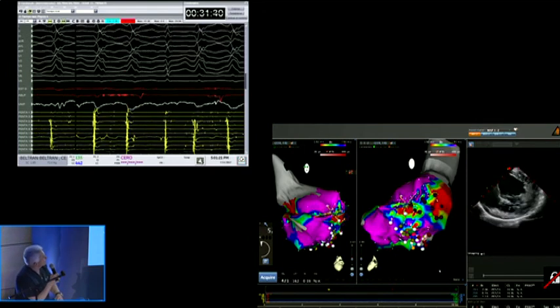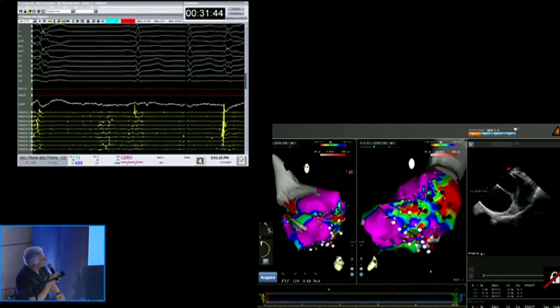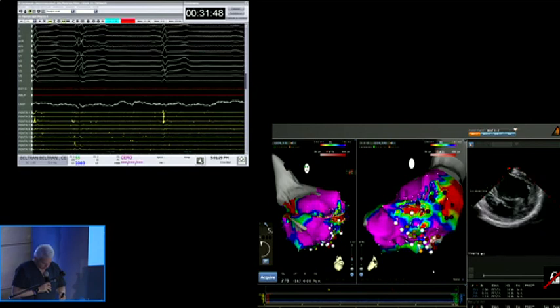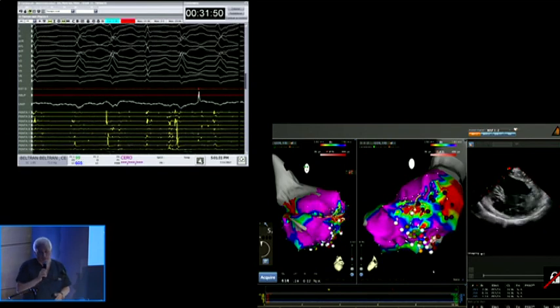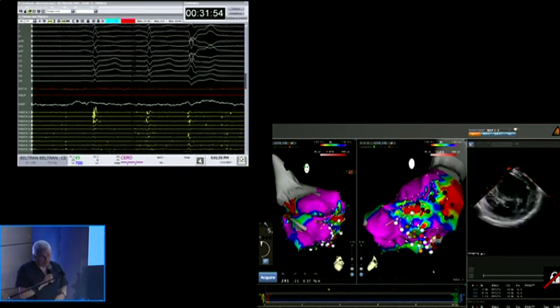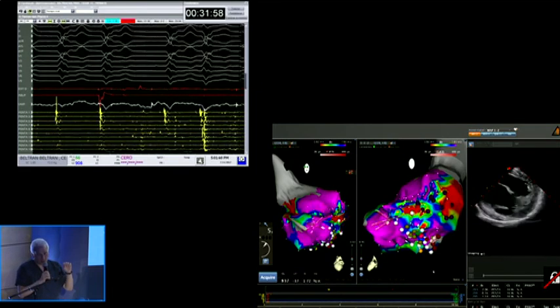Andrea, coming back to the question I asked before, based on your experience, what about the size of the scar? That's a good question. So there is a difference. The shell with the penta-ray sometimes does not show you all the trabeculation.